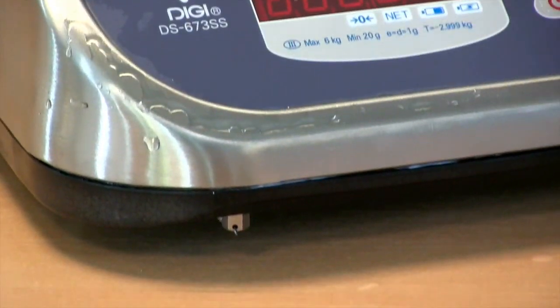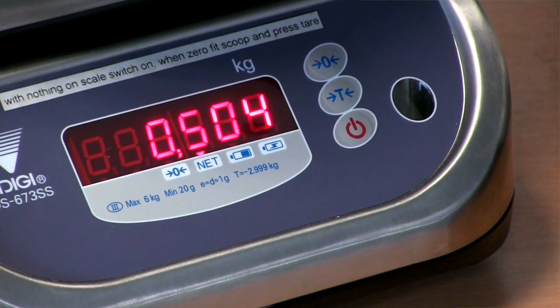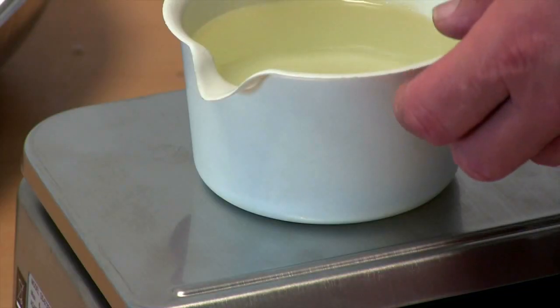Plus, with just three buttons it's very easy to use. There are two versions available: a 6kg option with accuracy to 1g and a 15kg version accurate to 2g. Here's how it works.